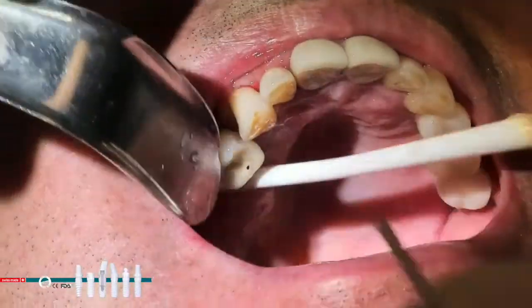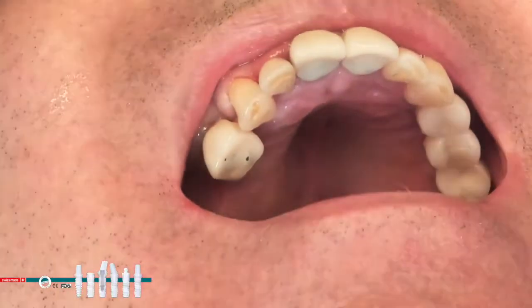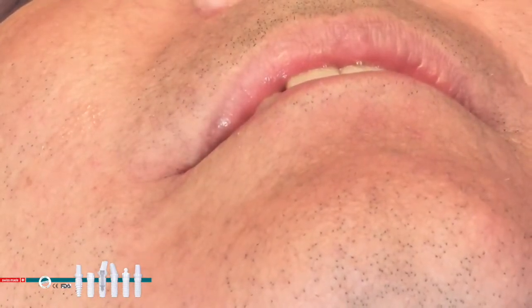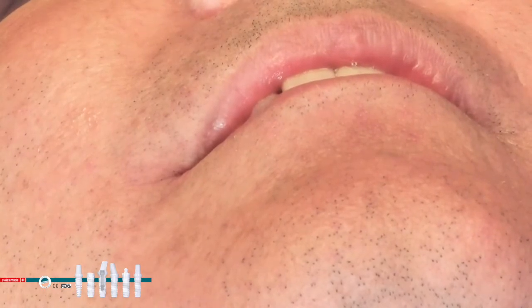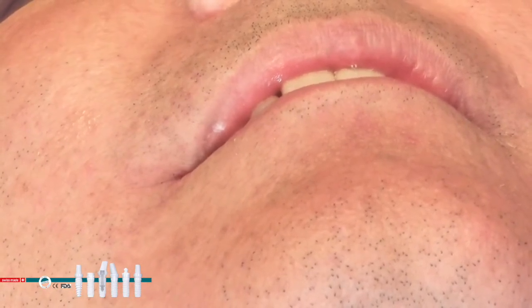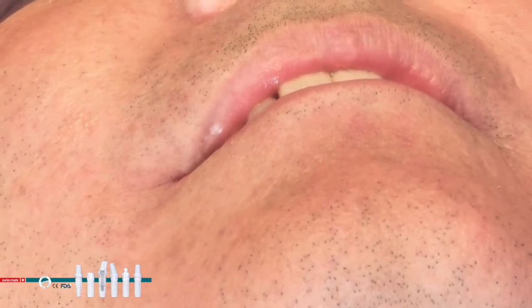Now, with this ceramic implant and these ceramic drills, do you have a different motor speed or hydration that you use? Is there any difference in that? The irrigation is the same. You make sure you have an irrigation system with your motor. The speed, I usually keep the RPM around 400 for the upper, a little bit higher for the lower because the bone is more dense in the lower jaw. Maybe about 600, 650 RPM in the lower jaw, but nothing really high, like 800 or 1200.